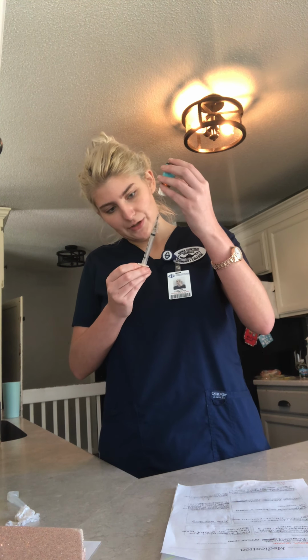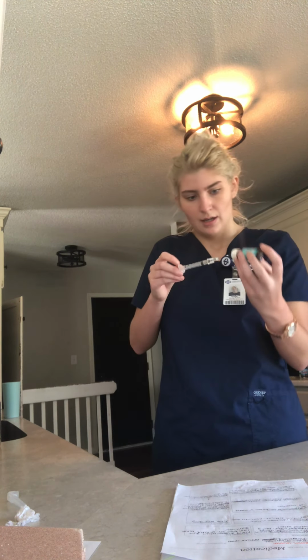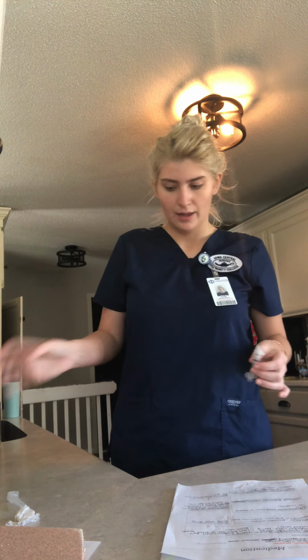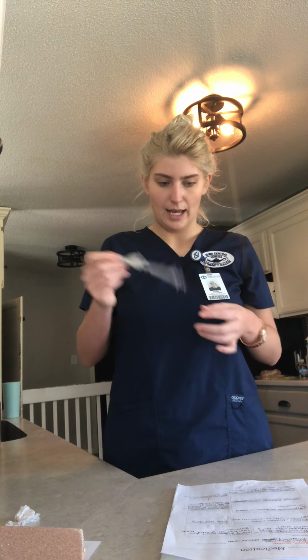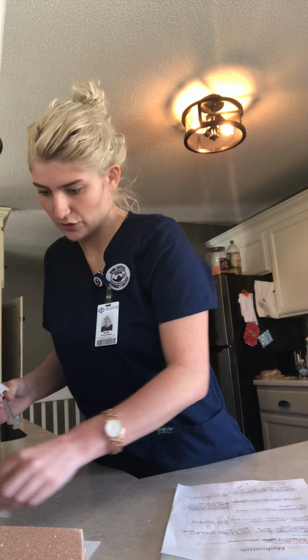Then I would pull back my syringe to 0.1 ml, and you can go a little further to let out air bubbles. And then you can take your needle out, tap the syringe to get the air bubbles to the top, and then push the air bubbles out. Just make sure that your medication dosage is at 0.1 ml on your syringe. And then you can change your needle, making sure it still has a safety cap on it. So now your medication is prepared. And once your medication is prepared, we can now go to the patient's room.